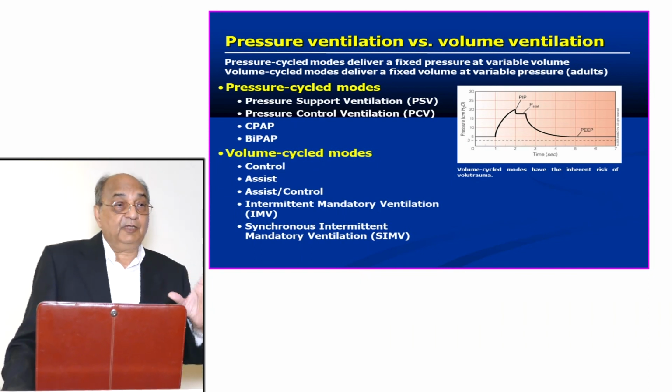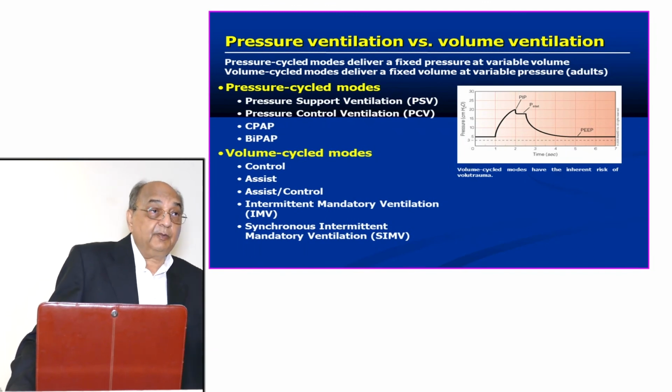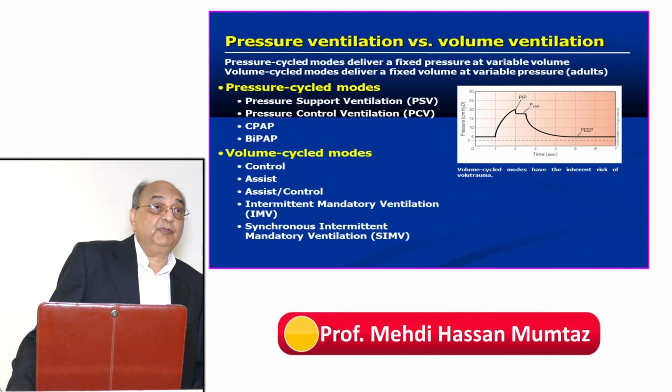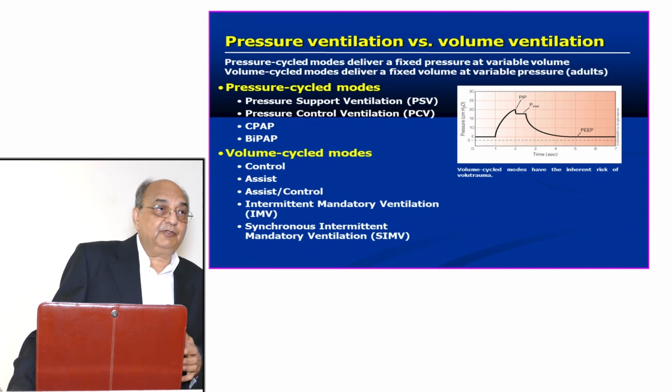So always keep that in mind. But as we have in our mind that we have to bring the patient back, we put on SIMV, synchronized intermittent mandatory ventilation. It means you are ventilating a patient, but you are giving time for the patient also. If he or she desires to breathe, they can breathe in between. It can be pressure-controlled, or it can be only volume, SIMV volume.